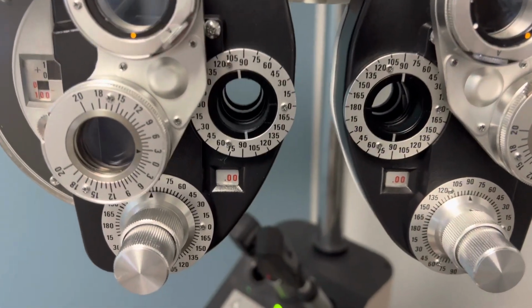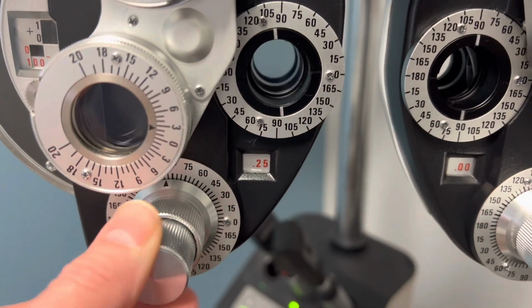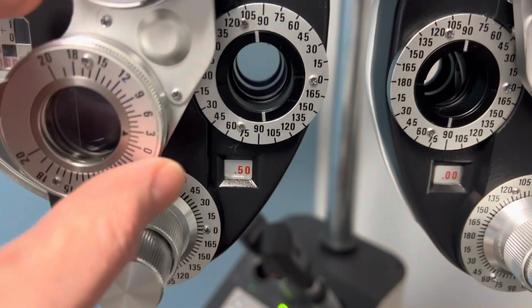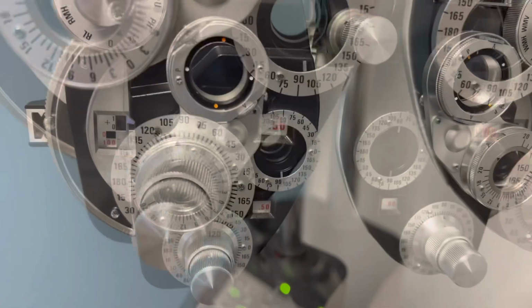If we come down here, we have our astigmatism dials. This red number here is the amount of astigmatism power that you have, and this clock dial is what's called the axis of astigmatism.